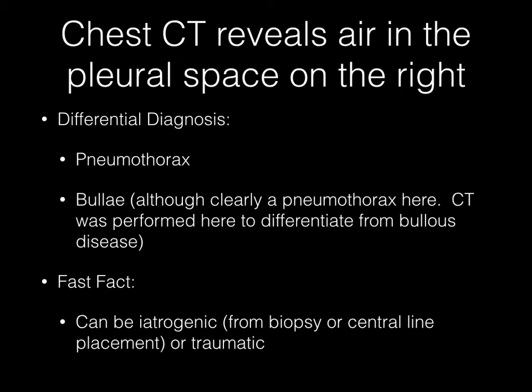Axial CT image of the chest reveals air in the right pleural space. The differential diagnosis here is pneumothorax, and this is clearly a pneumothorax, although bulla disease can also be added into the differential diagnosis.